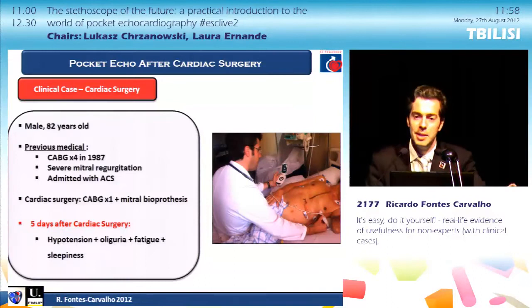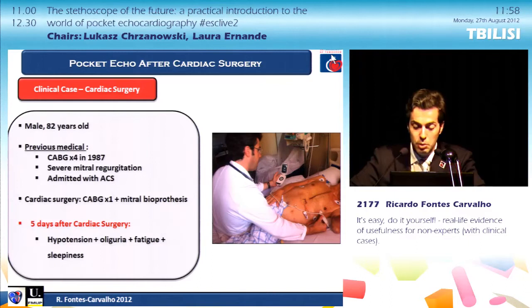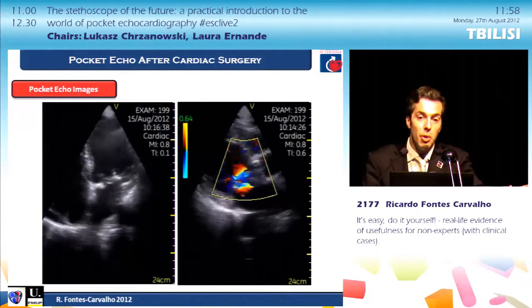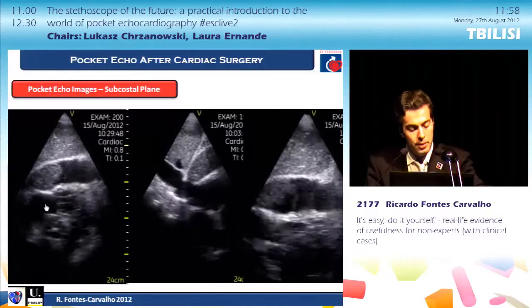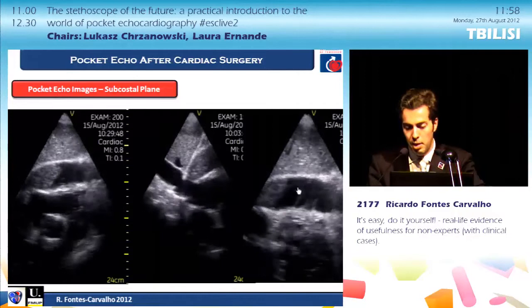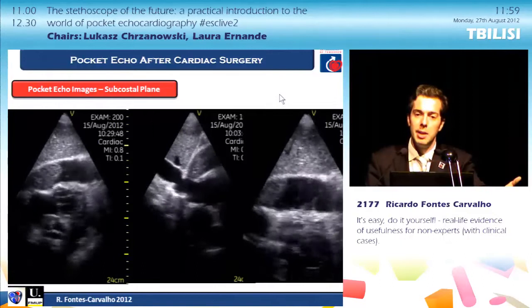The last clinical case: a patient five days after cardiac surgery was hypotensive, had oliguria, fatigue, and sleepiness. They called me to the thoracic surgery department. At first glance the prosthesis seemed okay, but in the subcostal view, I could see the right ventricle and right atrium compressed, a strange mass, and an undoubtedly dilated inferior vena cava. There was a pericardial effusion with fibrin inside. The patient was immediately sent to surgery, and this enormous clot in the pericardium was confirmed — exactly what we were seeing with the pocket echo.